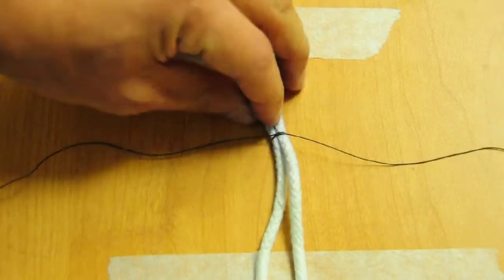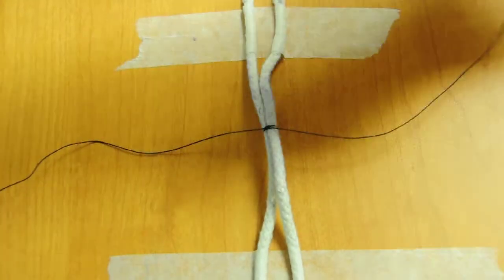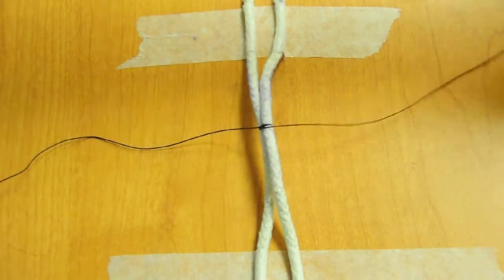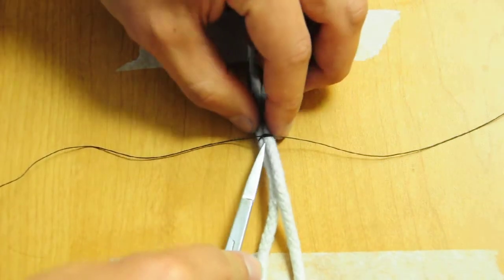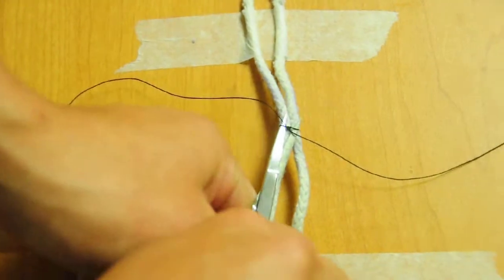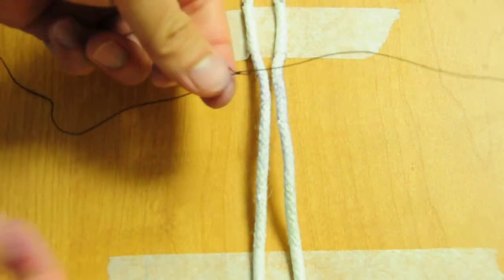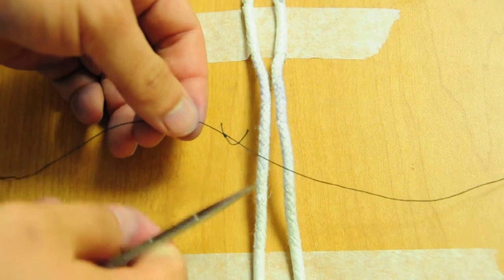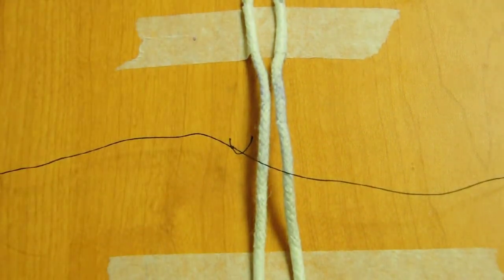Okay, so it's a nice square knot, like a perpendicular incision line. The way you test your knots, you take your sharp scissors, put them in between here, you open them up, and your suture should break before it slips. See how the knot's still in there, and the suture's breaking before it slips.